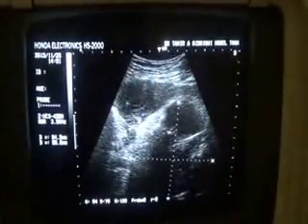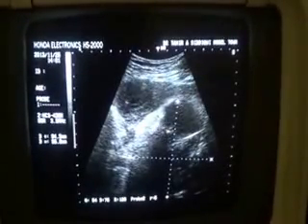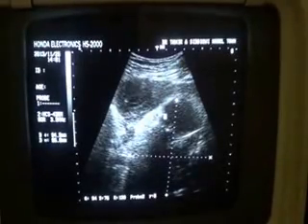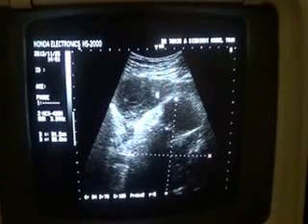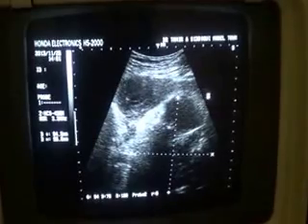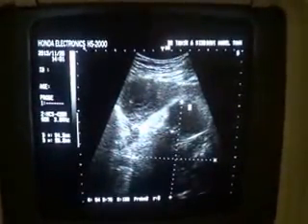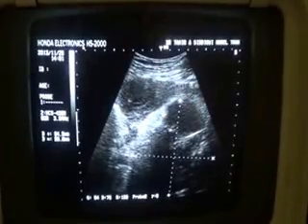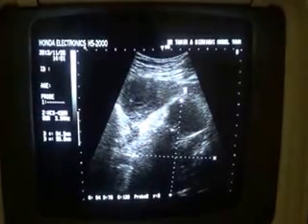And this is the endometrial canal, and she is in mid-cycle. This is a complex, solid cystic mass with internal calcifications that I will be showing you later on. This is the fundus of the uterus, the body of the uterus, lower segment, and the cervix. These you see are being stretched, and the uterus is anterior to this mass, and the mass effect is only to the extent that this lower segment is being stretched.